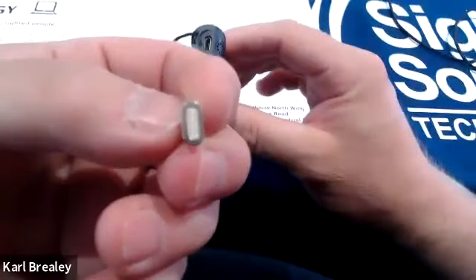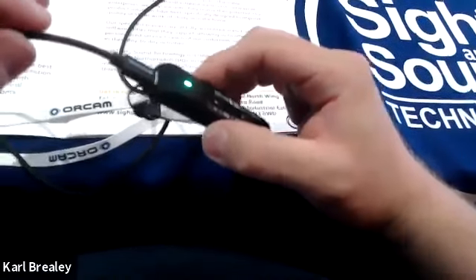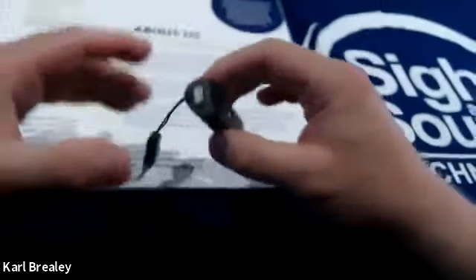On the back of the device, OrCam came up with these really clever magnetic charging ports. So basically, it is a tiny little nubbin of a charger that clips into the end of the device. And then when you use your charging cable, it has a magnetic connector on the end. So when you get anywhere near, charger connected. I hope. Battery is 94% charged. Hopefully you heard the clip. It clips on, it starts to charge straight away.